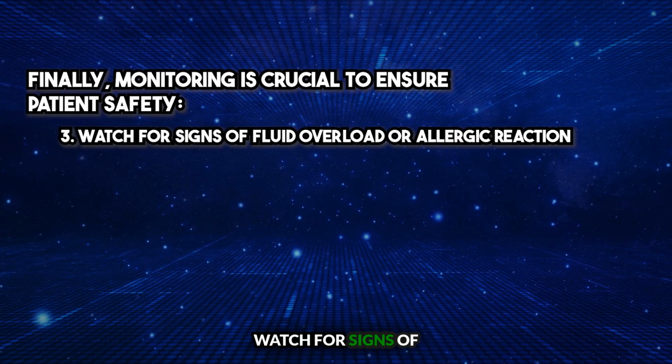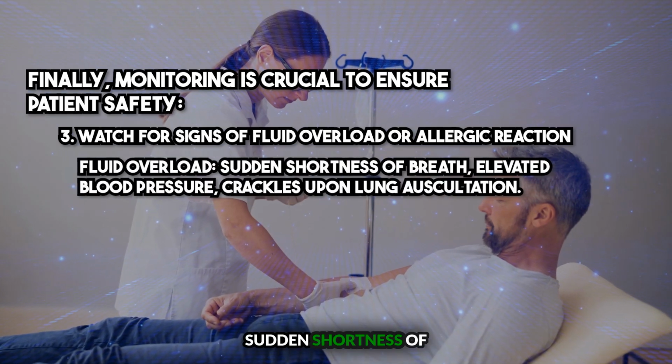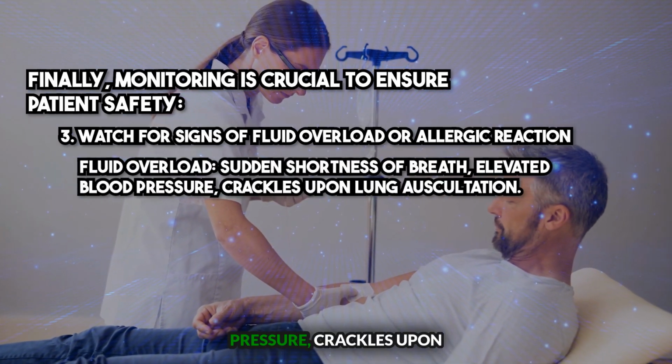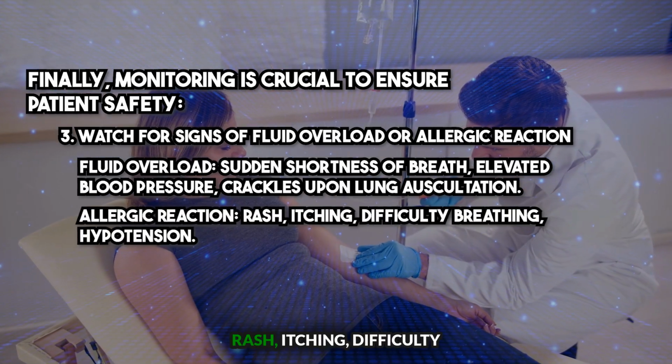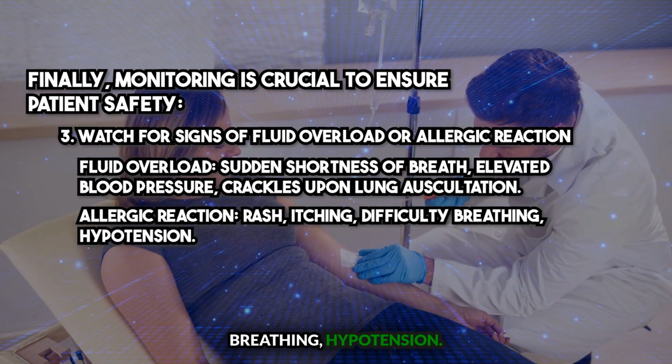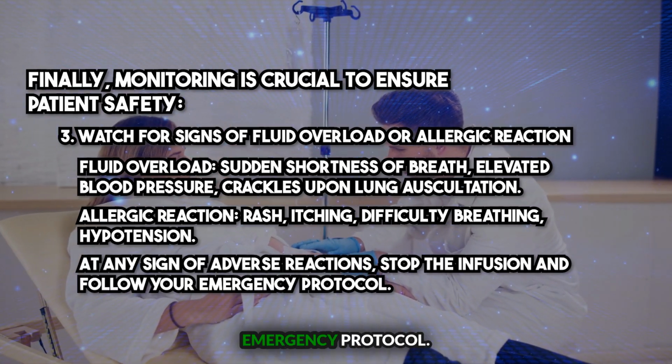3. Watch for signs of fluid overload or allergic reaction. Fluid overload: sudden shortness of breath, elevated blood pressure, crackles upon lung auscultation. Allergic reaction: rash, itching, difficulty breathing, hypotension. At any sign of adverse reactions, stop the infusion and follow your emergency protocol.